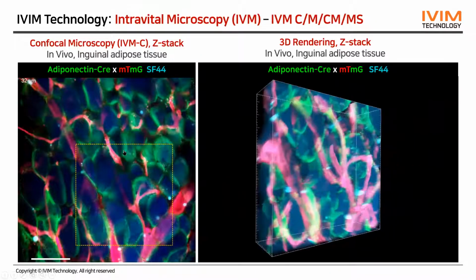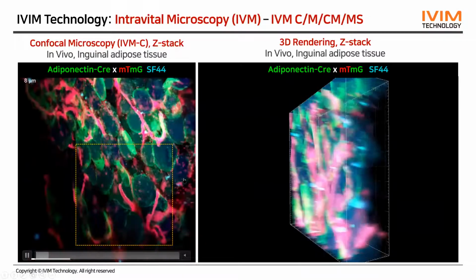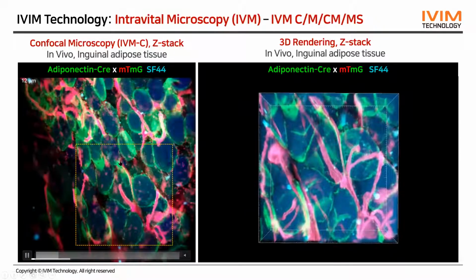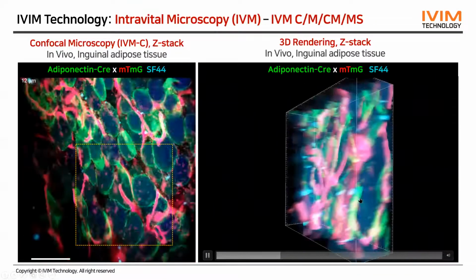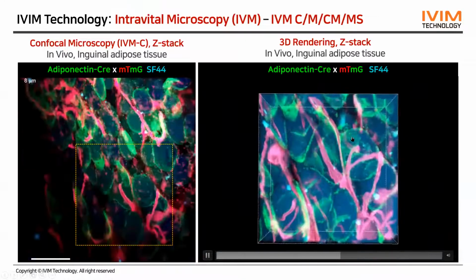All this green is adipocyte, and all the other red signal is other types of cells, most of them actually blood vessel endothelial cells. And Confocal microscopy can obtain sectioned imaging, so we can achieve this very high resolution, subcellular level images in the live tissue in vivo.